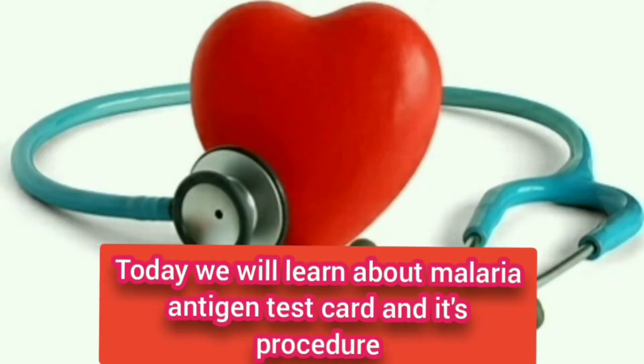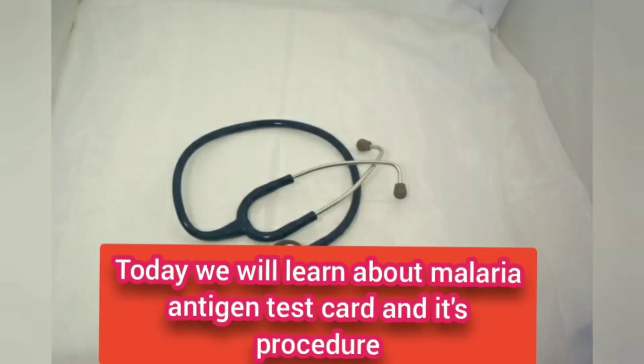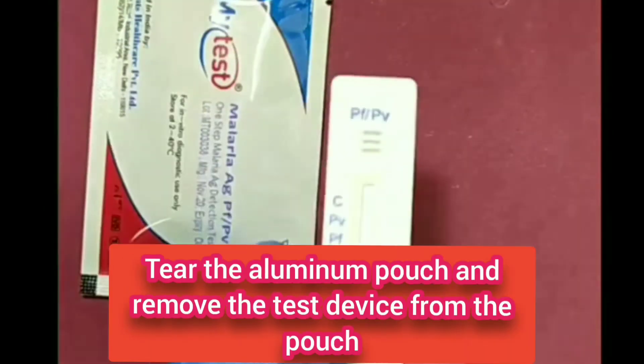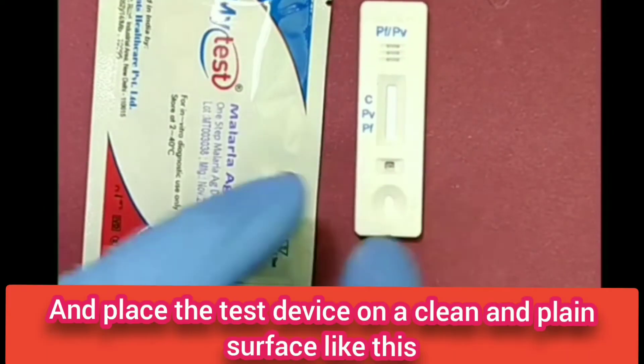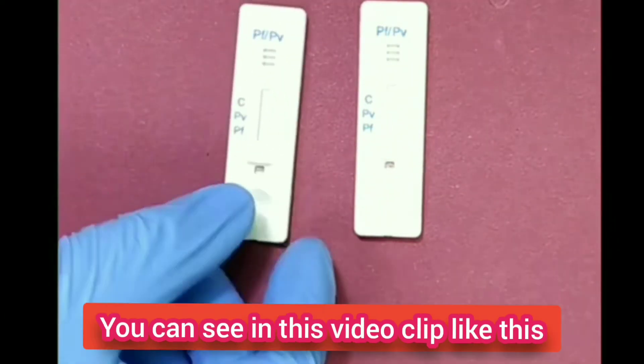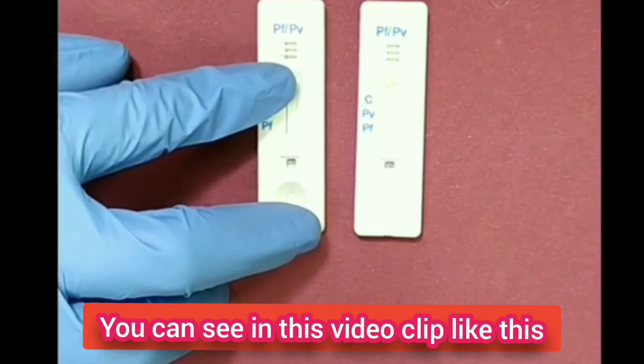Today we will learn about the malaria antigen test procedure. Open the aluminum pouch and remove the test device from the pouch and place the test device on a clean and plain surface, as you can see in this video clip.